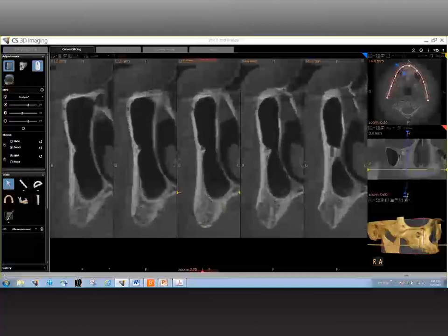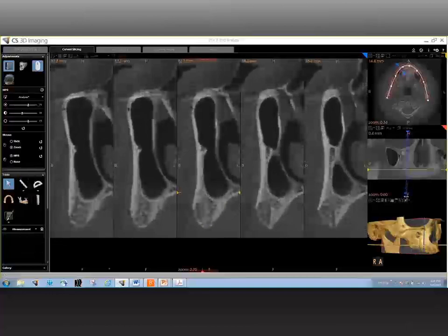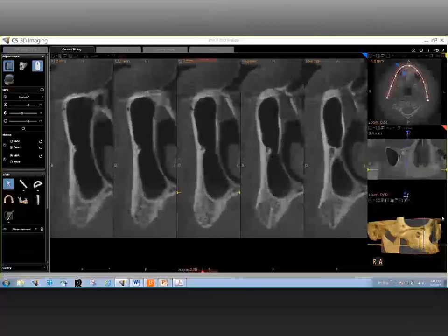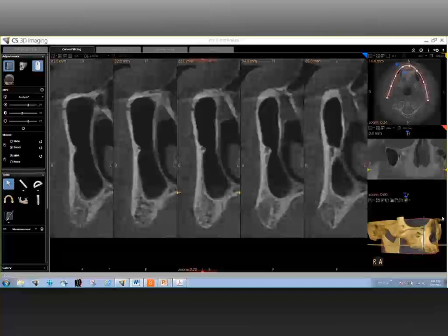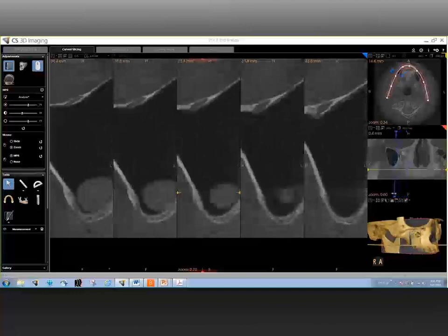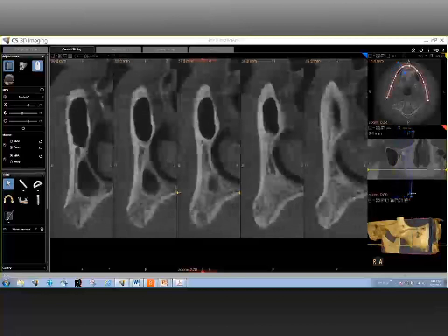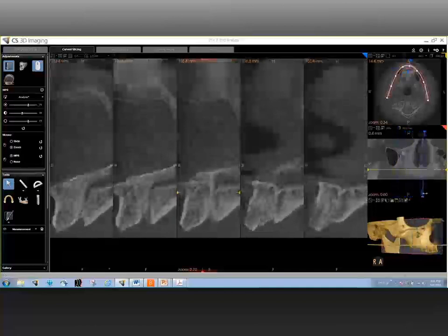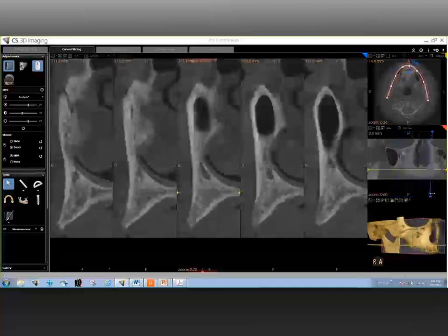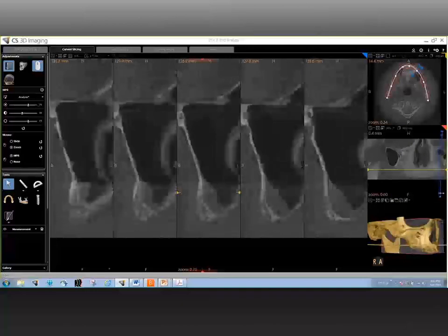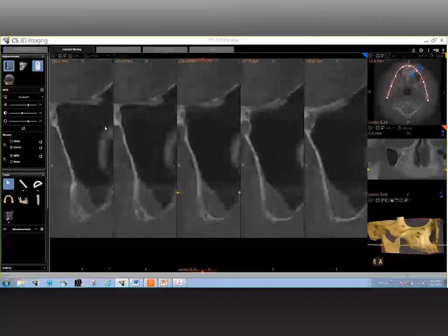The key point to note is that just on one side of the patient, you've seen the variation all the way from a non-existent ridge to a ridge that could go up to 8, 9, or 10 millimeters in height. Is it common to see that large a discrepancy between the anterior and posterior height of the ridge? In patients that stay edentulous for a long period, resorption can be seen depending on the thickness of the bone that existed and the type of extraction that was done. On patients who have stayed edentulous for a longer term, it is absolutely possible. This also shows the value of CBCT imaging in such patients where you suspect a large amount of ridge atrophy.